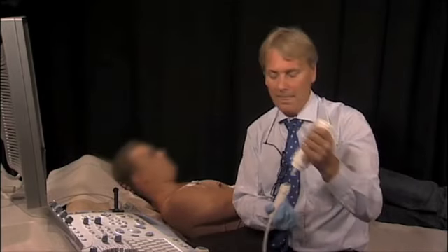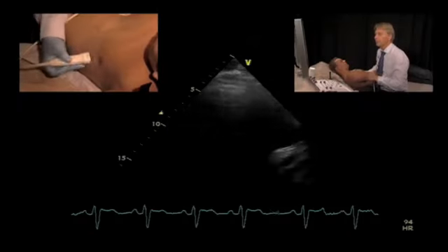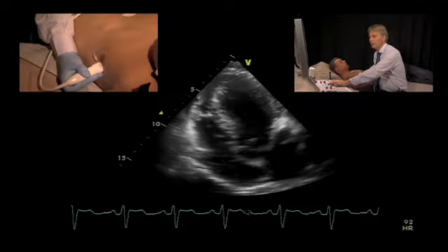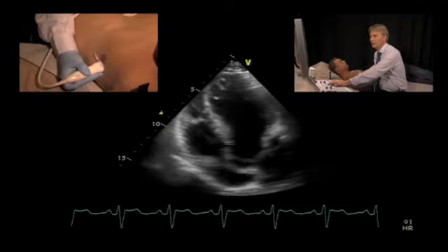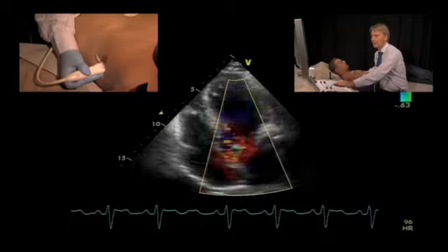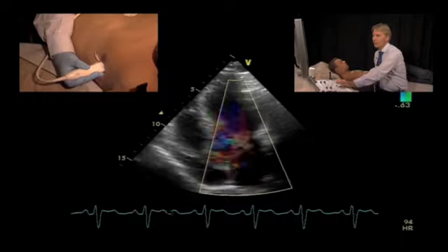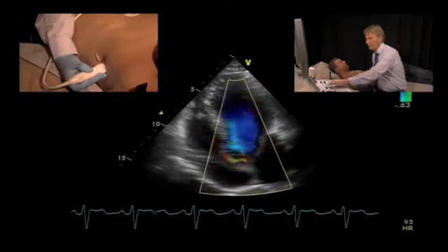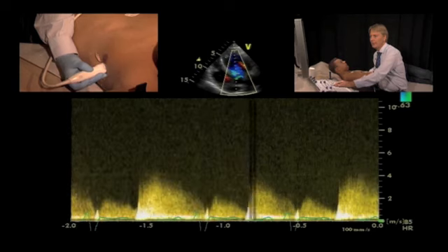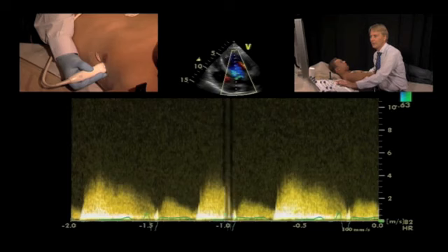I will now show you how to use the continuous wave Doppler spectrum to quantify the severity of aortic regurgitation, and I also want to show you how problems can arise and how difficult it sometimes can be, and what the limitations of this technique actually are. So, in principle, you would start with a 5-chamber view. Try to orient the 5-chamber view in such a way that you have a parallel orientation towards the ultrasound beams. Then we would place the region of interest with the color Doppler to give us guidance where the jet is, and with the continuous wave Doppler we will then try to go right through the origin of the jet, which we're trying to do here, and then we would get a spectrum, in his case, which looks something like this.